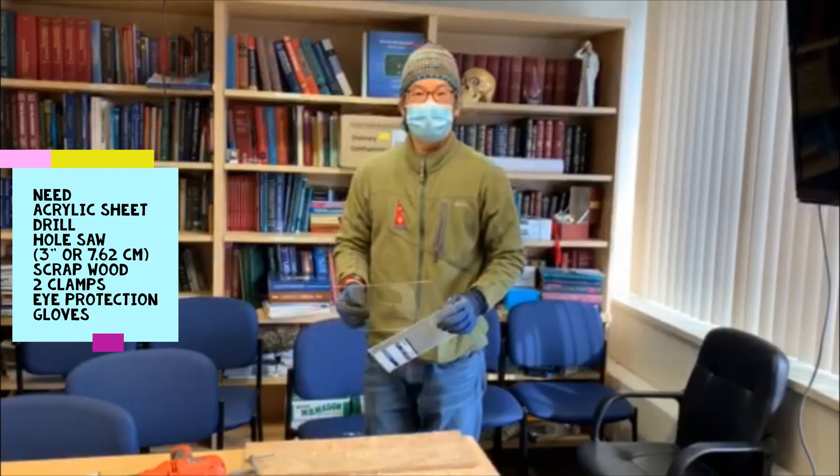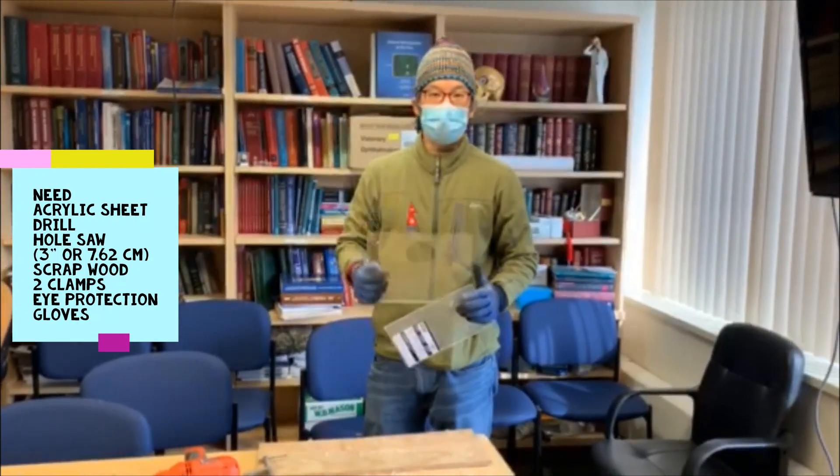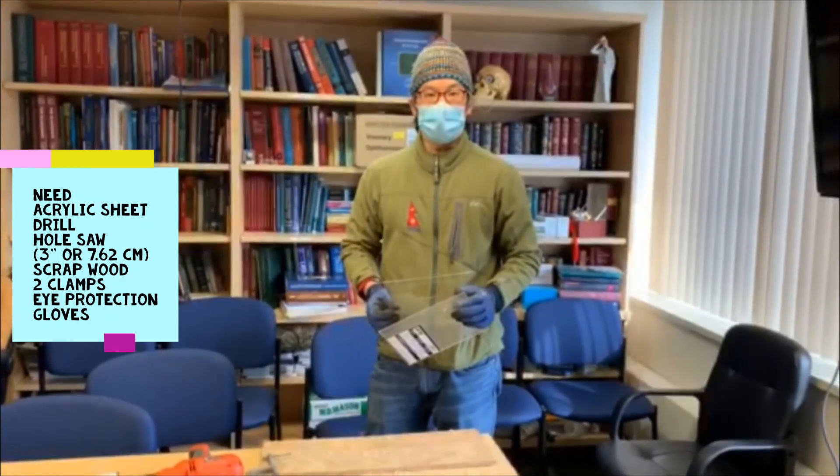Hey everyone, Chris Tang here, just showing everyone how we can make nice slit lamp shields — larger slit lamp shields to protect us from any sort of vectors while we're examining patients.